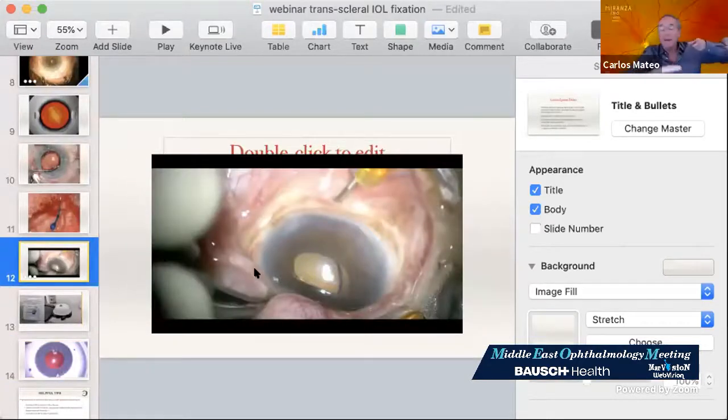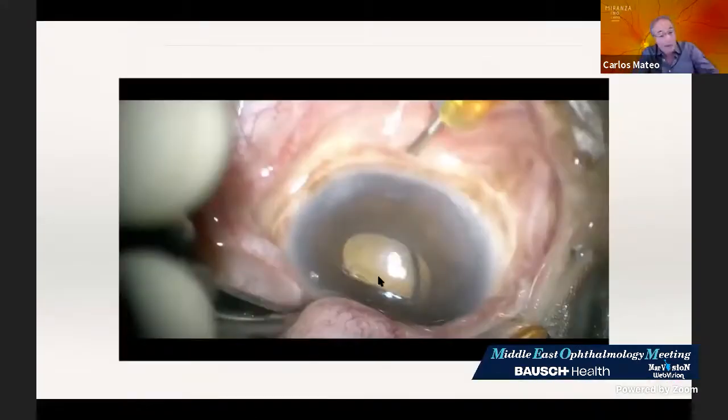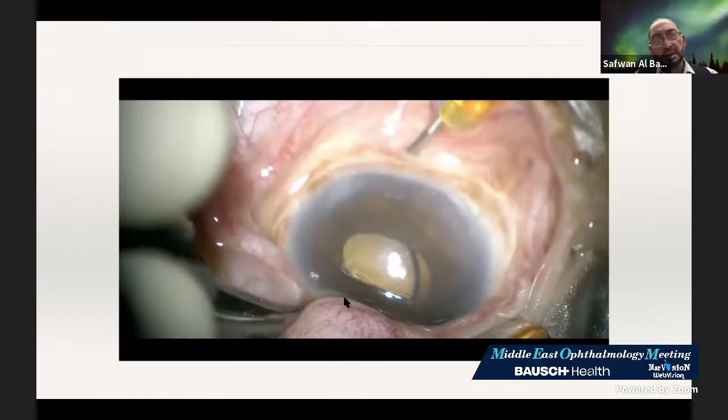And you see the syringe and the needle. And you have a small iris. To see it, you have to gyrate the needle 90 degrees. Then the sclera, the tunnel is not that good. It happens to me. It's difficult to maintain a good tunnel when you have a small pupil. It's very difficult. Yes. Yeah, I do agree with you.